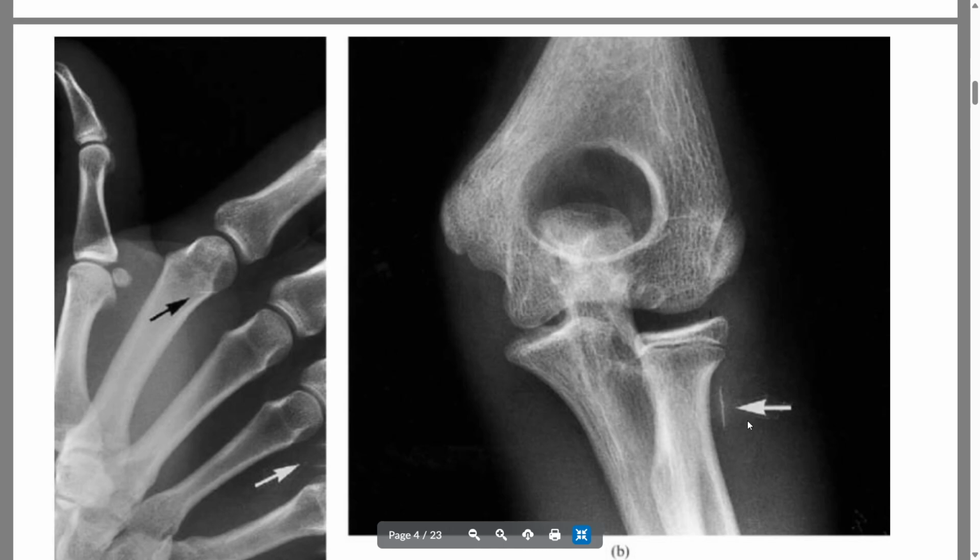Even a foreign body, maybe they scraped their elbow outside and got metal kind of shoved within their soft tissues there. So there's a bunch of different things this could be, but it turned out to just be a scratch on the IR. So things like that can occur and cause radiologists to think one pathology when it's just an artifact.